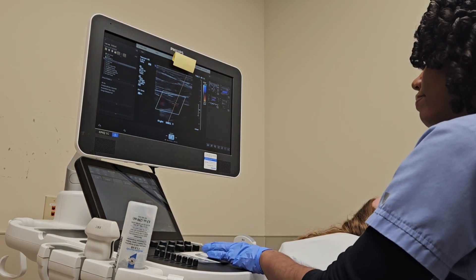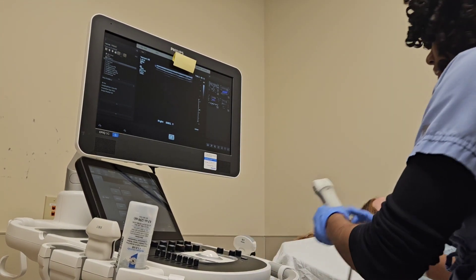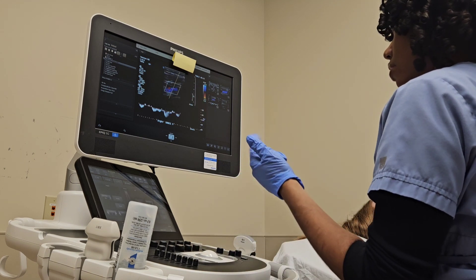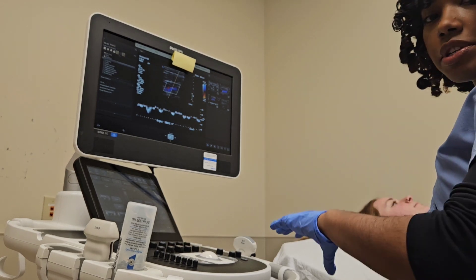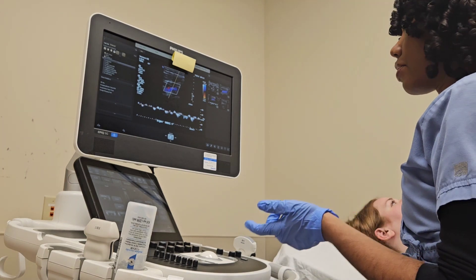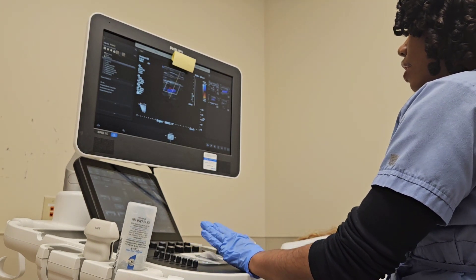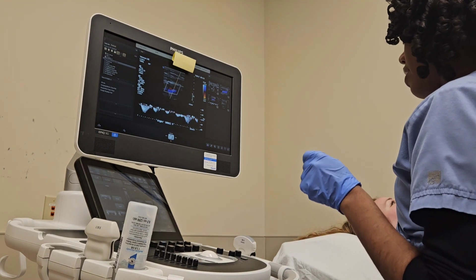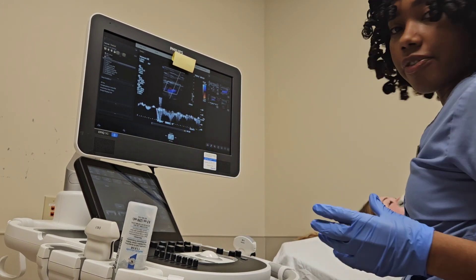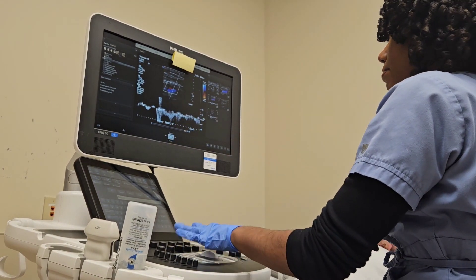I'm going to take the image in 2D. Here's my trick: you can squeeze the inside of the patient's arm, or — I learned this from my co-worker — you can get them to sniff really hard and fast through their nose. Let me make sure I'm on the vein. Skye, can you sniff really hard and fast through your nose? Look at that — that augments the blood flow going back towards the heart. We type augment for the image. Boom, subclavian done.